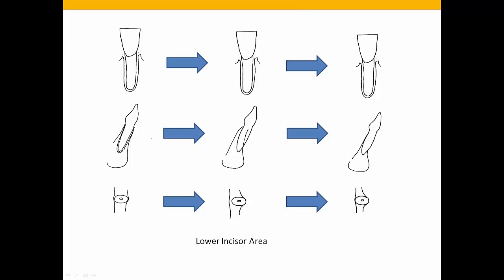If you look from the axial view, you could see the tooth is centered within the alveolar bone. Then you have the orthodontic boundary violation. You get interseptal bone changes or a flaring of the bone to help support the tooth, because you still do have tension in those areas. And then you get adaptive resorption of the lingual bone in this case.